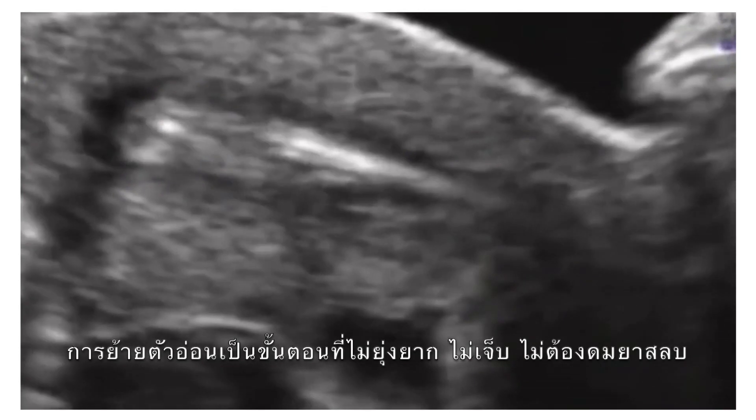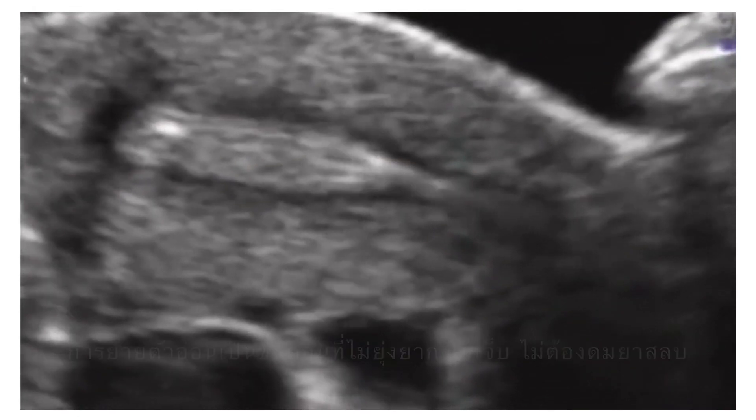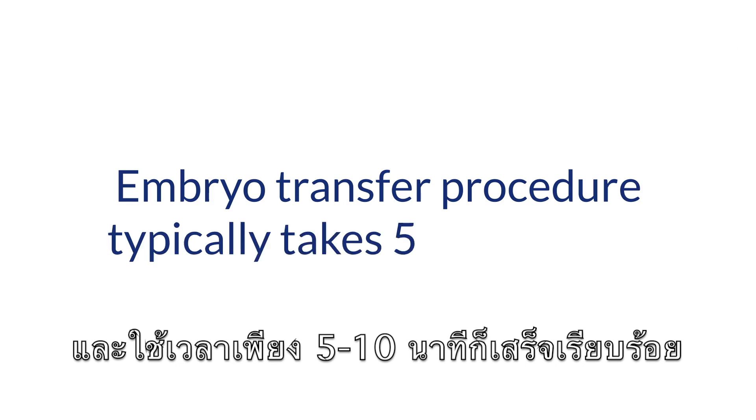The embryo transfer is a simple procedure that does not require anesthesia and takes around five to ten minutes to complete.